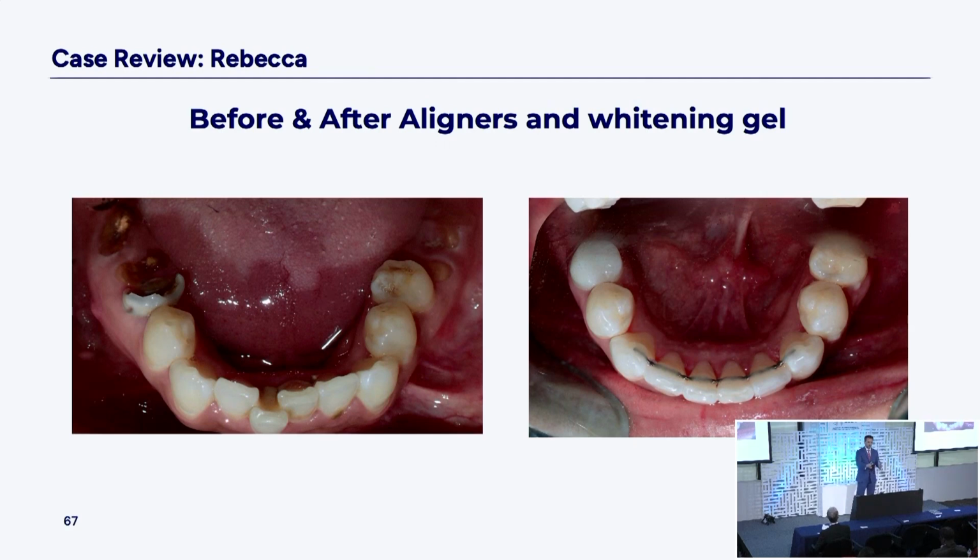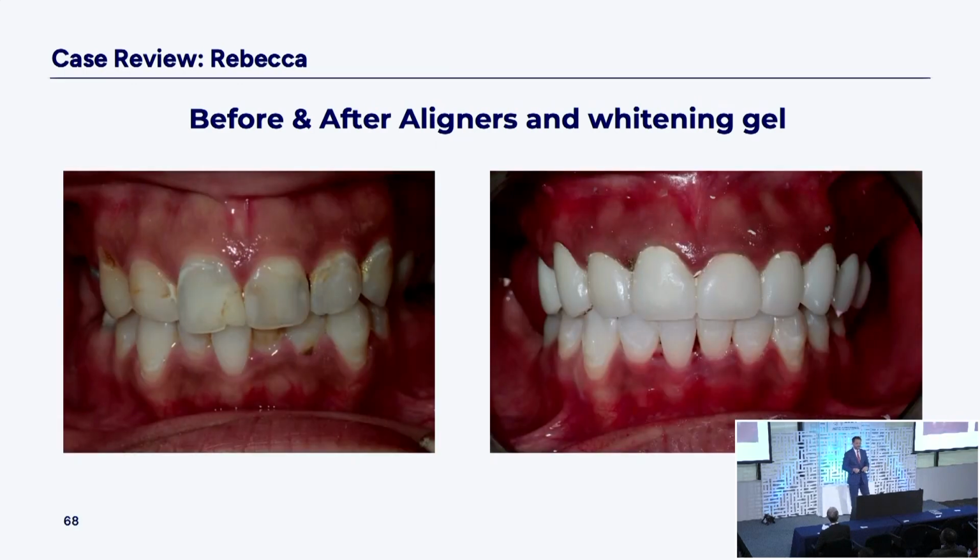But we did have this increase. You can see the premolar expansion, the canine expansion, no IPR. We've lined up the teeth, put the lingual bar. We got a crown there on number 29. 29 has a nice one. But now we're going to get from temps to final.